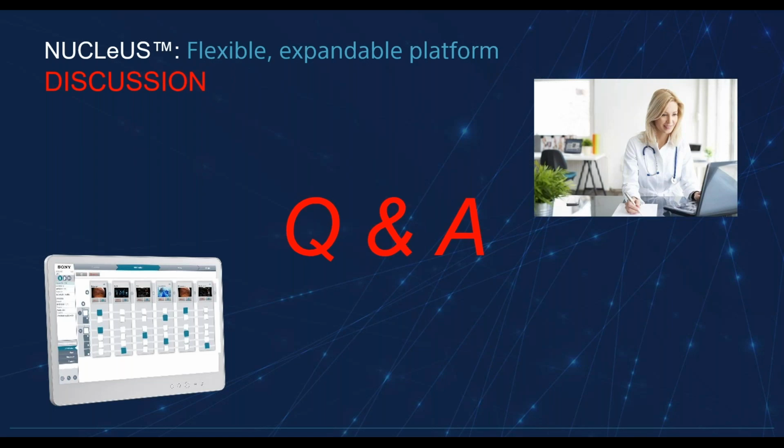Anybody else have any questions? I have with me Marco Manjares, who is our network system guy, and then we also have Shogo Obuchi, who is the product manager for and subject matter expert on Nucleus. We have a question: what kind of latency can we expect from a transmitter to receiver? It's in the millisecond range. We don't give a specification on that, but it is less than 2 frames.